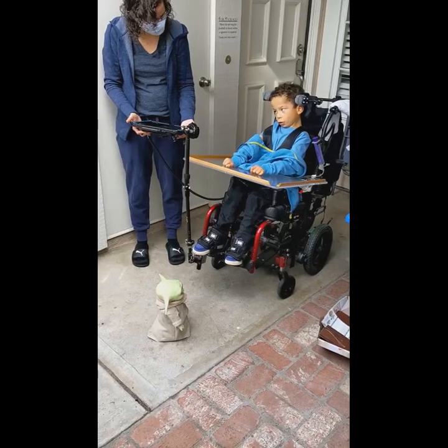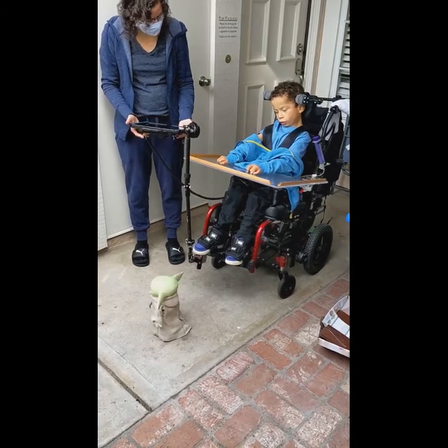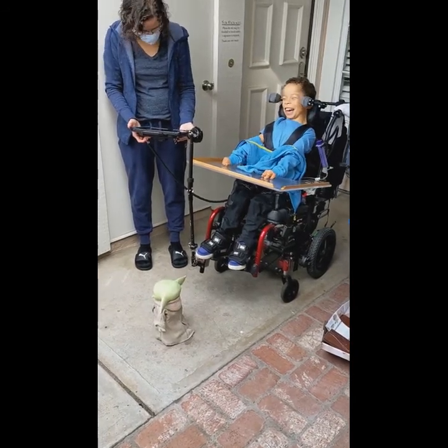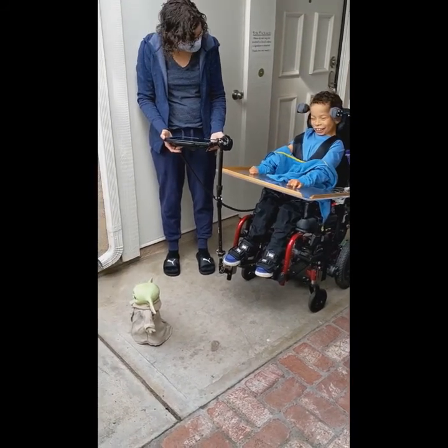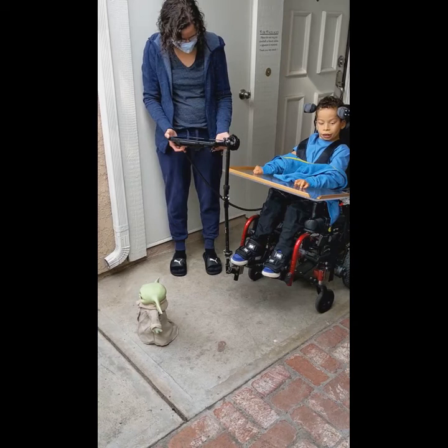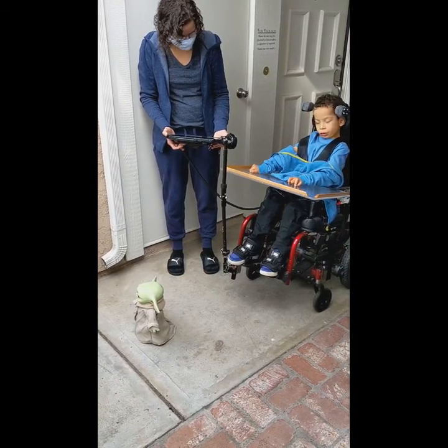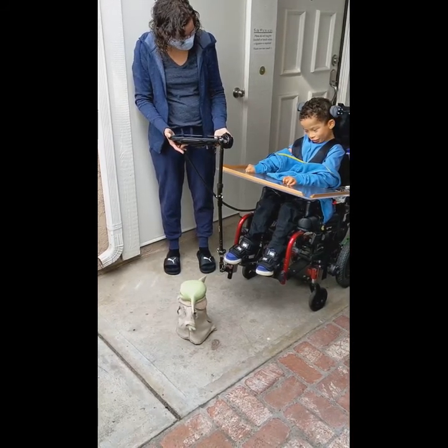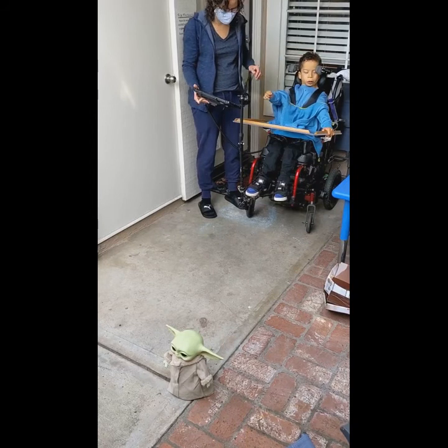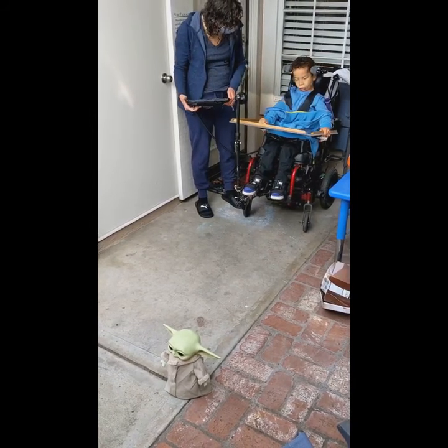Can you make Baby Yoda go, Tyler? Turn left. Whoa, there he goes. Oh, he's walking forward. Can you make him go again, Tyler? Backward. Whoa, there he goes. He's going backward. Talk to me. You heard him talking to you, Tyler?